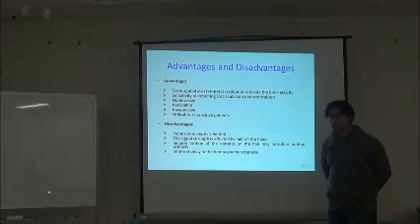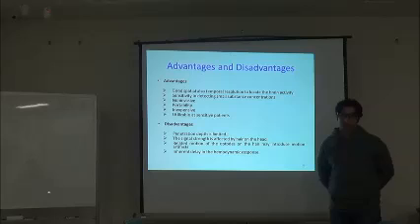So it has some inherent delay, and that is one of the issues that we have to address: to reduce this delay, to get some other response, to look into the initial dip, to focus more onto the fast optical response.